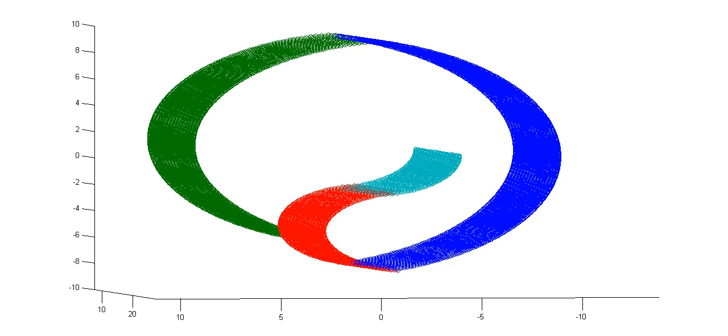Then I can show a person new images of the same categories and see if I can correctly predict just by looking at the voxels what image they're looking at. So you've trained a classifier on your voxel patterns, and then you test it using newly collected voxel data.